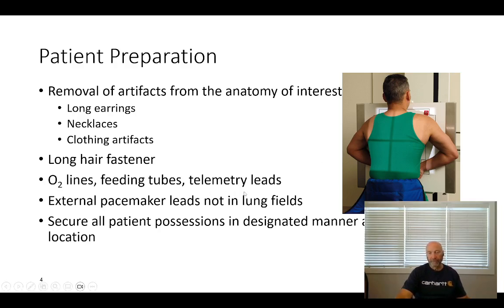Telemetry lead, I spoke about this in the previous video, but your tendency is to want to look at your telemetry leads, and that's heart monitor with leads, the wires that plug into the patient's chest, is to take those and put them on top of the image receptor, or top of the bucky, along with all the other stuff.